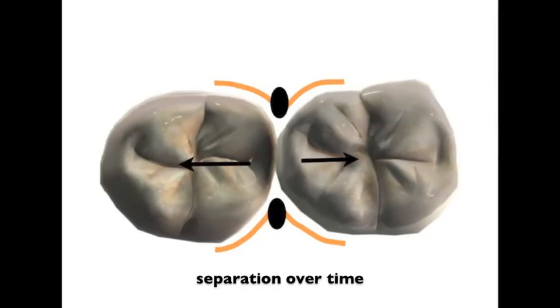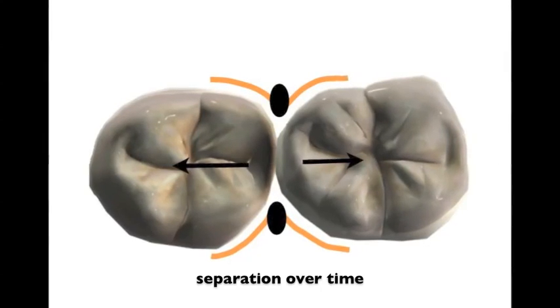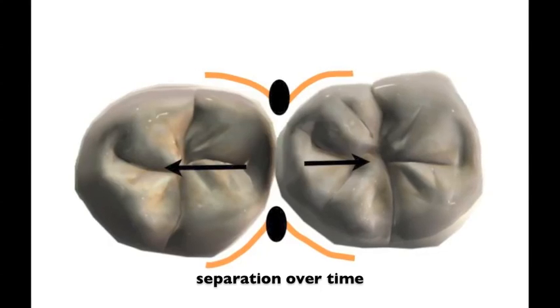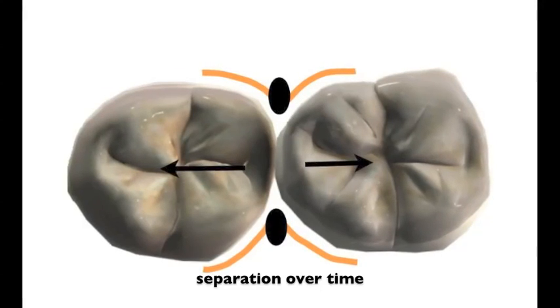The key to success is to separate the teeth over time. I pre-wedge all my teeth and then I use a separating ring system that allows the teeth to be constantly under pressure to compensate for the thickness of the matrix band.